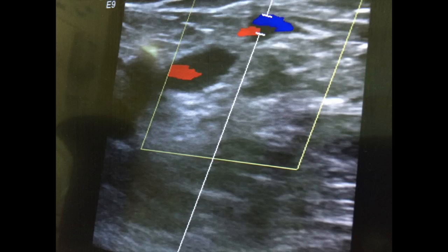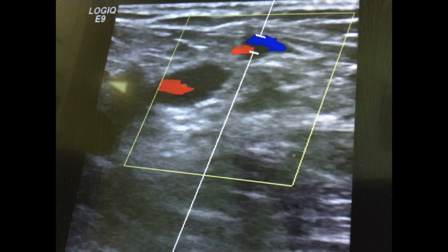While performing the ultrasound with Doppler in the medial groin, we found a mixed flow of density and velocity. The differential diagnosis — the very first thought is arteriovenous malformation, and the second differential diagnosis is arteriovenous fistula.